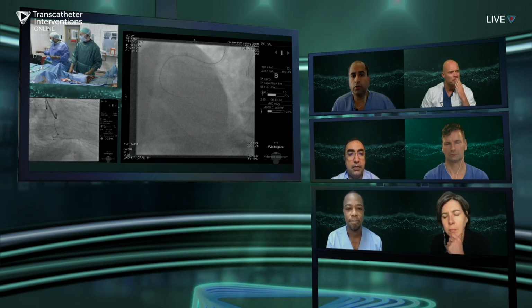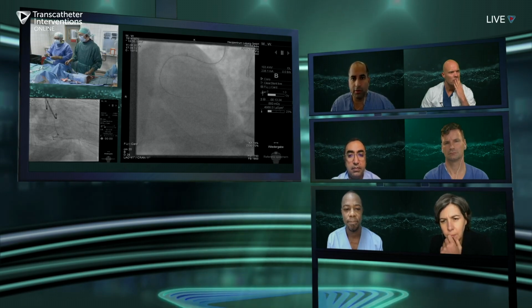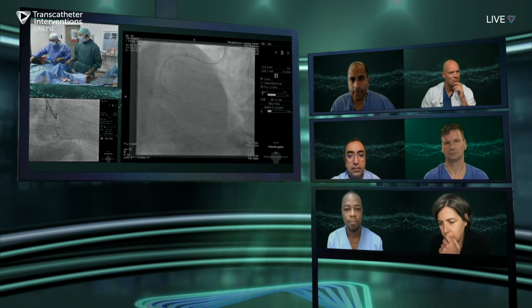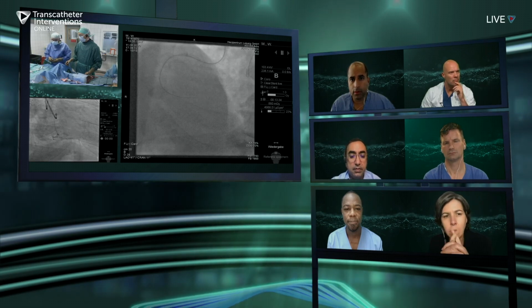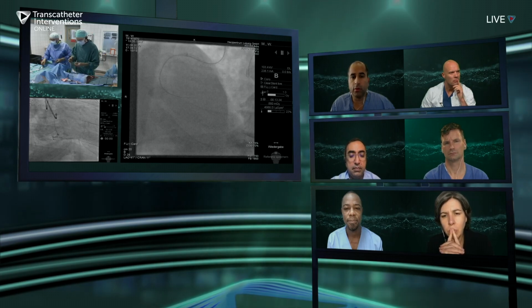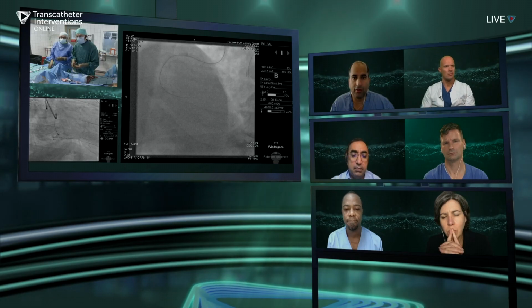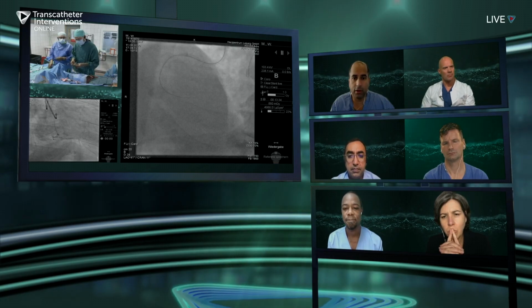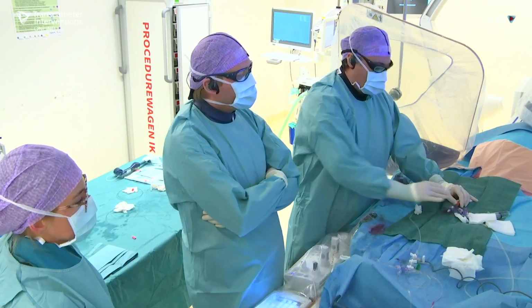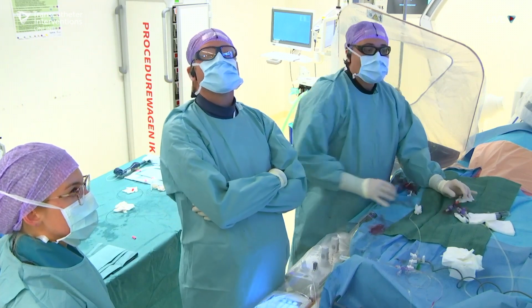So why don't you do this? Erasmus is ready to take us, so why don't we go back to Erasmus, if you don't mind. Do you have the wire? Why don't you store the fluoro, if that's okay? Because they're waiting for us, and then of course we'll come back. Yes, sure. That would be great. Thank you so much. Okay, let's go back to Erasmus. All right, tell us what you've done.